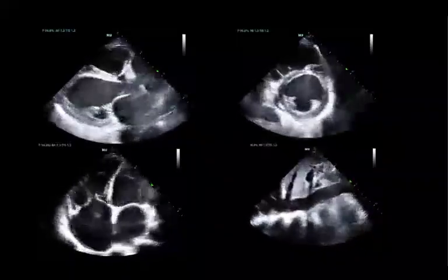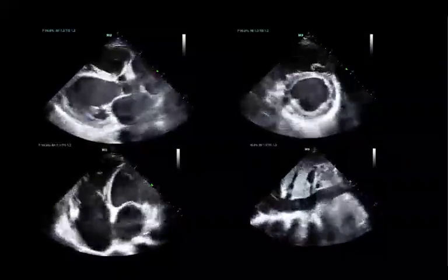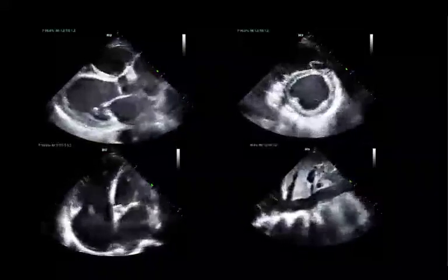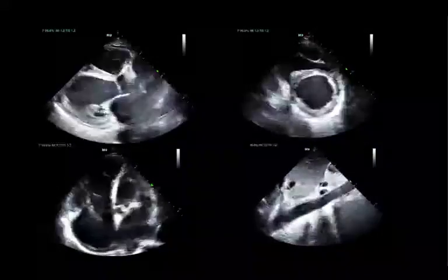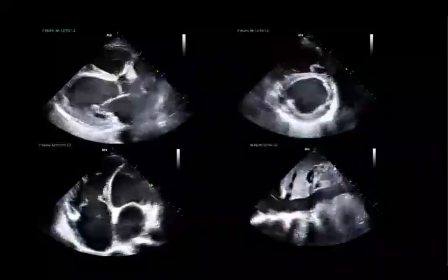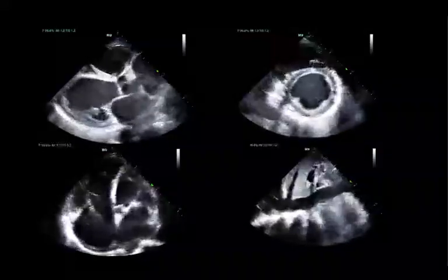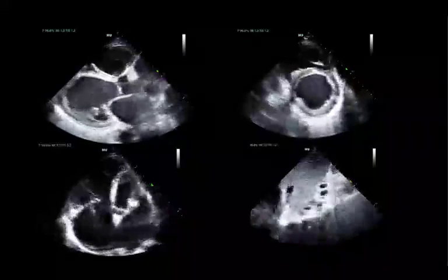When I started doing this, I would miss some things that now, having a little bit more training and more knowledge, I actually can take advantage of. For instance, in this patient here, it's clear that there's a decreased EF, but that left atrium is not normal. That is a massive left atrium. It's probably 6 centimeters. So that tells me that patient has probably long-standing severe diastolic dysfunction.